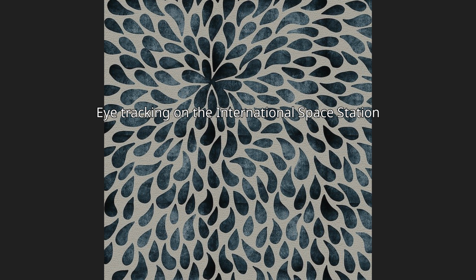The eye tracking device (ETD) is a head-mounted device designed for measurement of 3D eye and head movements under experimental and natural conditions. The tracker permits comprehensive measurement of eye movement (3 degrees of freedom) and optionally head movement (6 degrees of freedom). It represents a tool for the investigation of sensorimotor behavior, particularly of the vestibular and oculomotor systems in both health and disease.